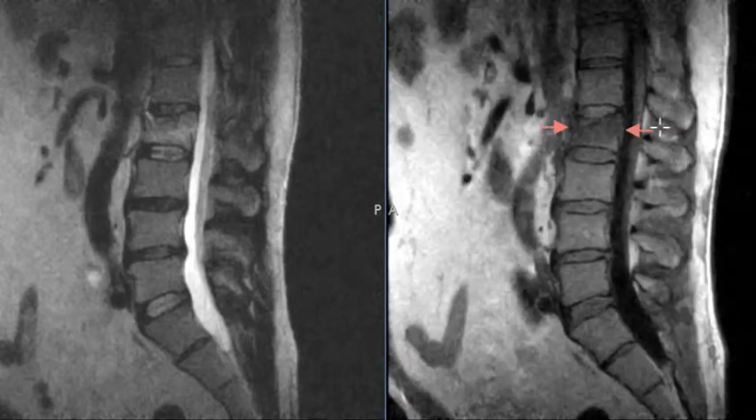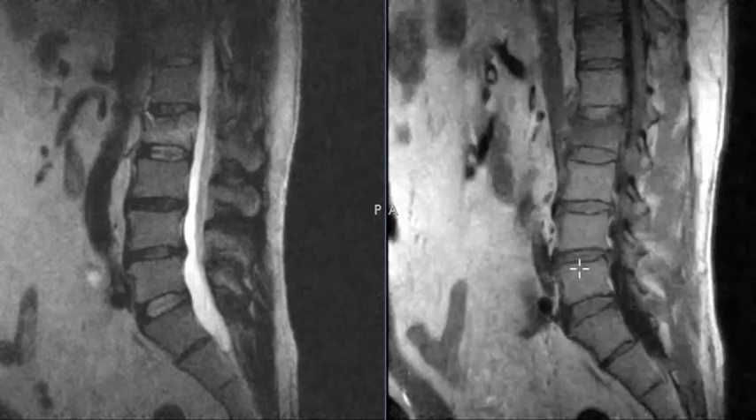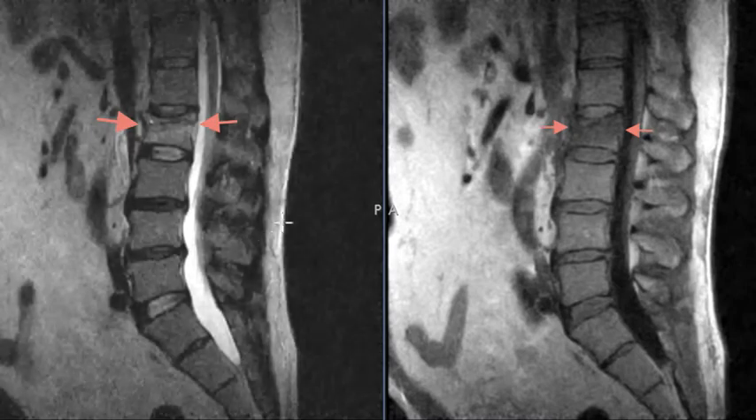Over here this is a T1-weighted view, and I have the arrow pointing to the finding here where fluid is dark. So fluid in the spinal canal is dark, and fat is really bright. Marrow has lots of fat in it, so it's very bright as well. We see these little discs in between to get oriented — these are the vertebral bodies and these are the discs.